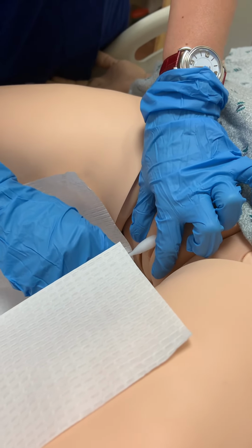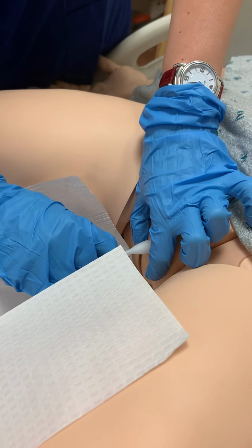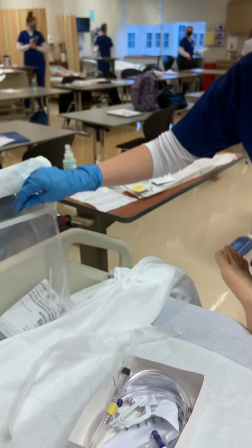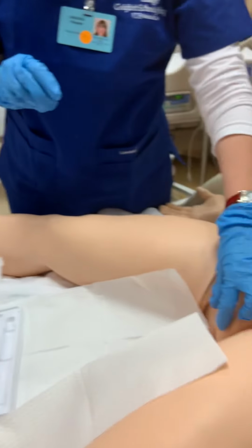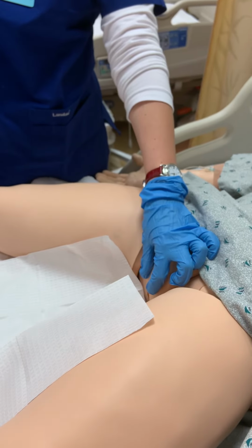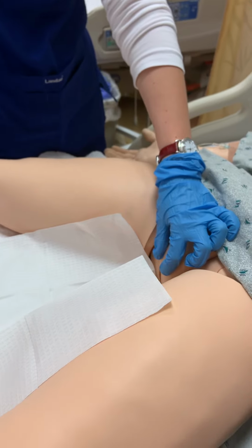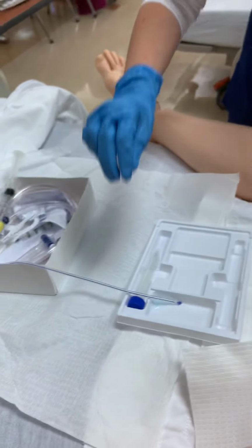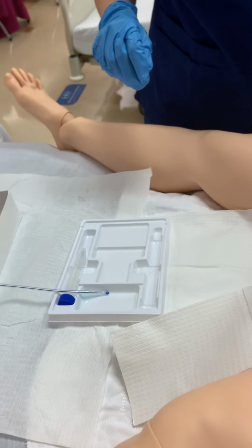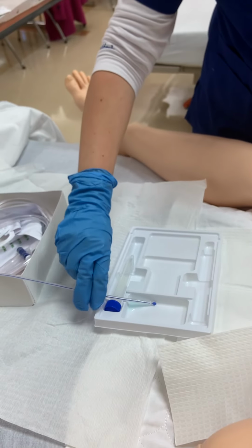You still doing okay, ma'am? Yep. Thank you for asking. Okay. Alright, so now I'm about to insert the catheter. I just wanted to let you know and make sure that's okay. Yes, thank you so much for asking. Absolutely. Okay, and please, if you feel any discomfort during this, please let me know, okay? Okay, I will.